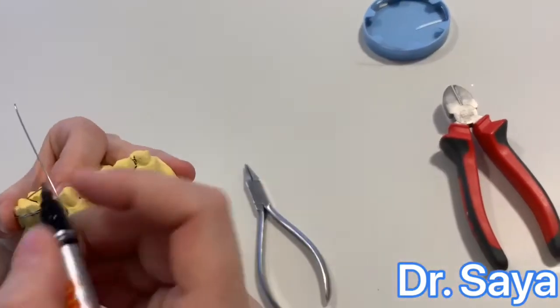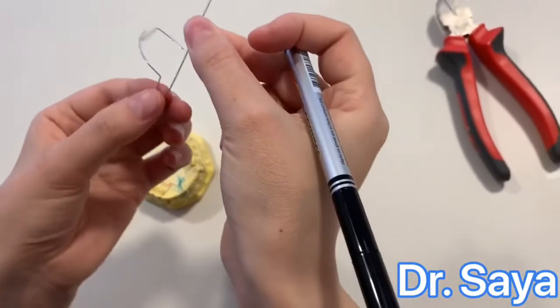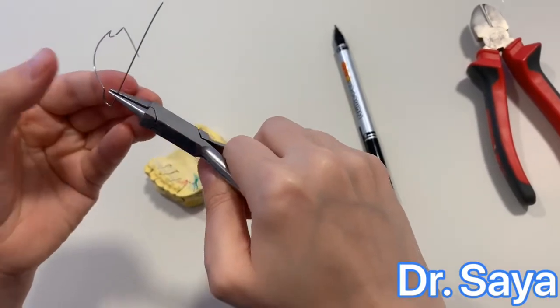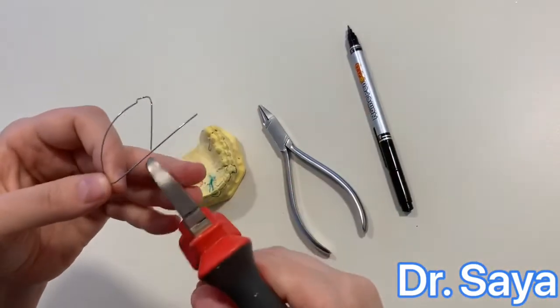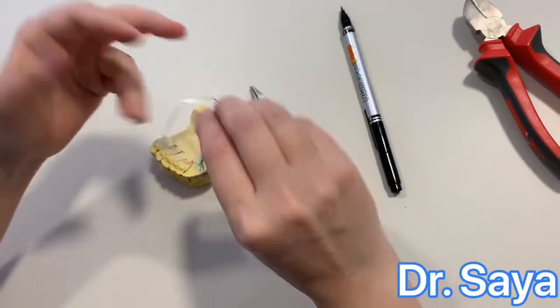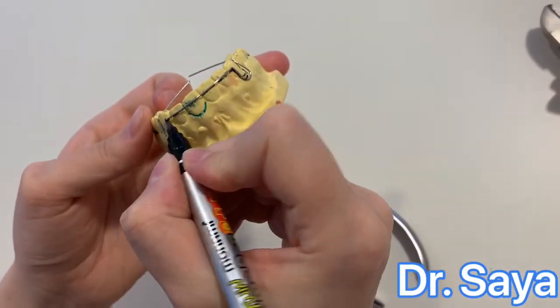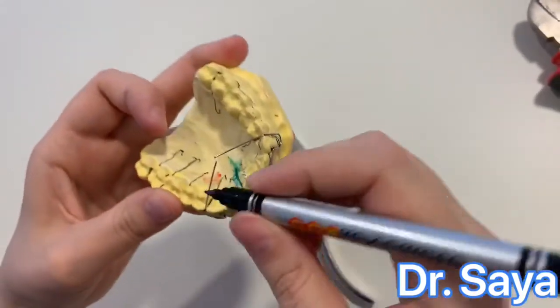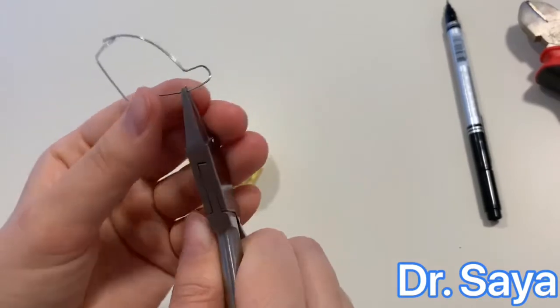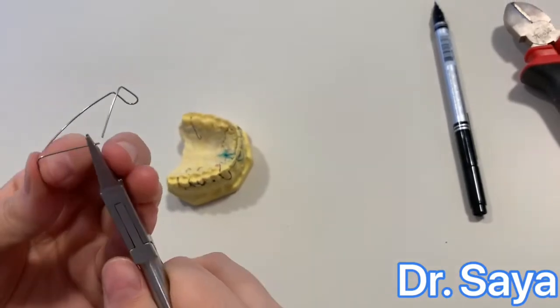This side is a little bit on the premolar — that's good. Mark the contact point between the canine and the premolar and, with the straight side of the Adam's plier, make a 90-degree bend. Now we have the incisal segment at the incisal third of the tooth and two vertical loops. We are going to adapt the retentive arms. After the bend, with the round side of the plier, make two retentive tags.